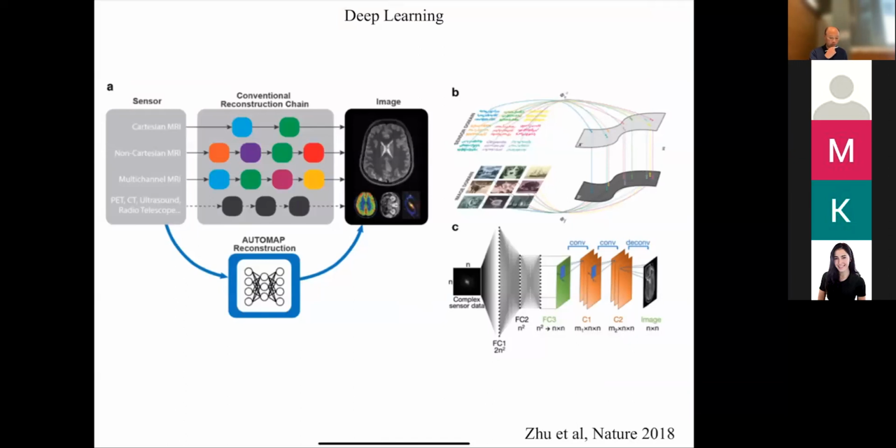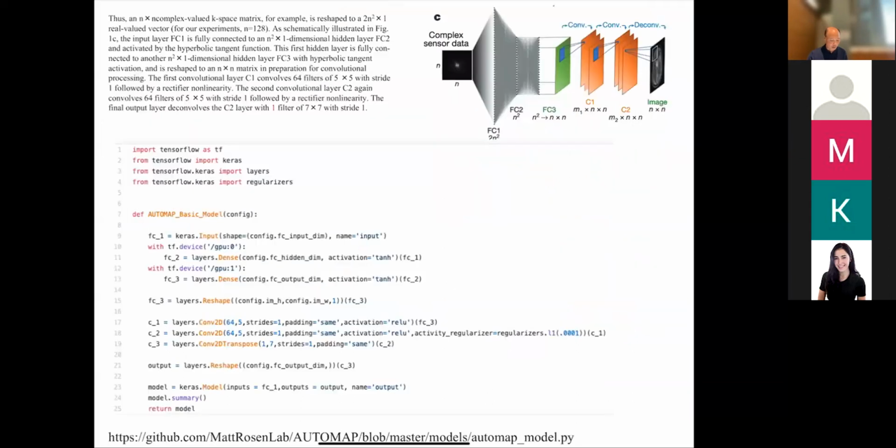Google, Amazon, they've made it so that deep learning is so easy to do. So we can take advantage of that. And so essentially, this is actually from the paper. This is the TensorFlow Keras code that this paper uses to generate the results that I'm going to show you. So literally, it's just that much code.